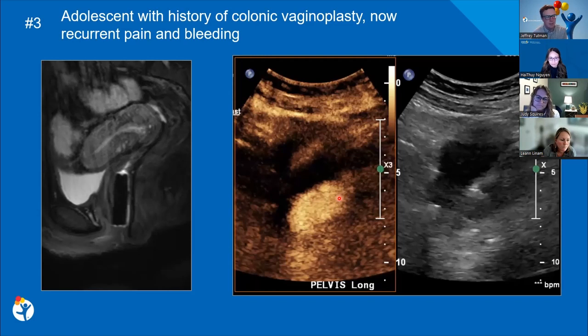Yeah, I think it's definitely dependent on your local referring clinics. We have a very large anorectal malformation population here. We haven't quite started using it for that, just because I think they're so familiar with fluoroscopy. I think it's definitely an avenue we could explore further. It's an interesting concept, and I've seen some of those cases from Boston. With the high pressure colostograms that we do in fluoro, with ultrasound you don't even have to use the high pressure component because you can see those little trickles of bubbles through. So maybe it's a little bit safer, but definitely interesting to think about.